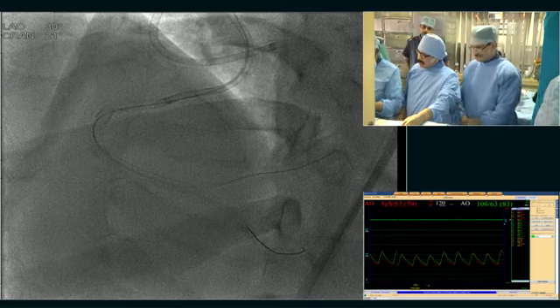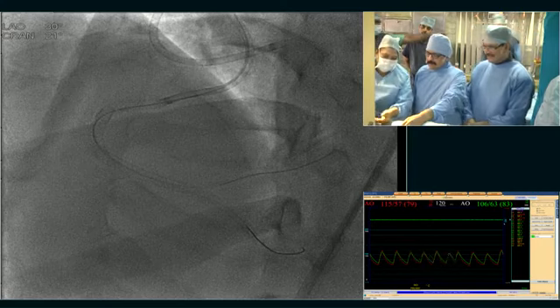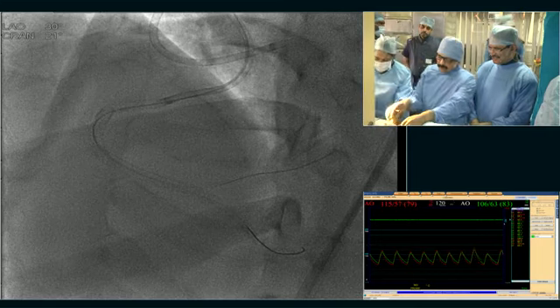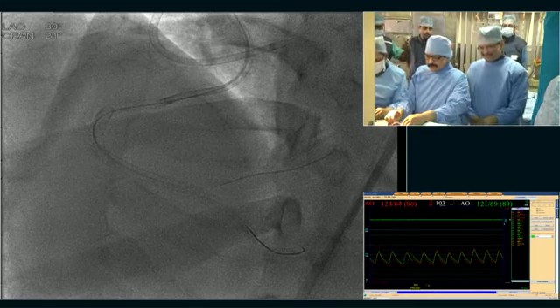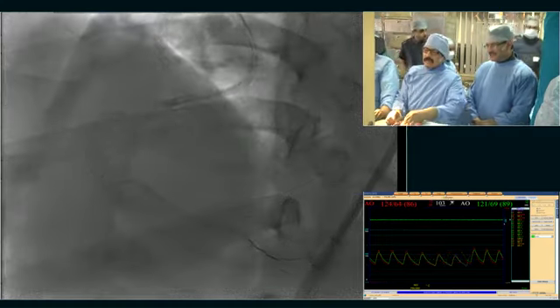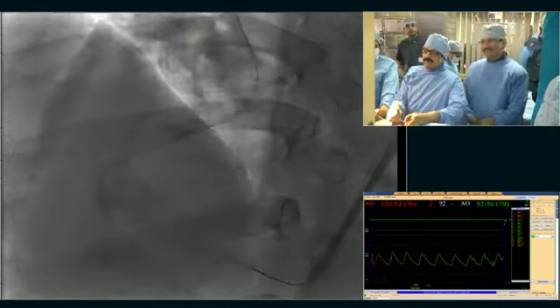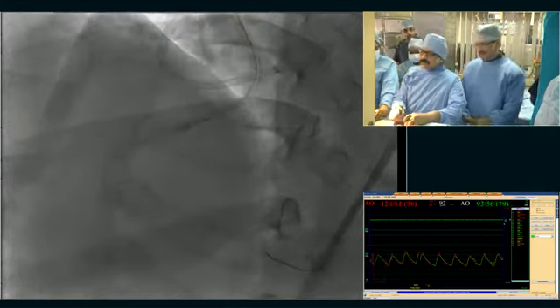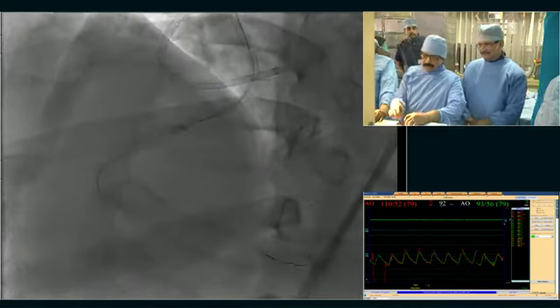So everybody is confident about the crossing of the balloon, 1.5. Tajuna? So far we are optimistic for this tough case. Hopefully, fine. For difficult lesions, tough lesions, Tajuna usually crosses this type of side branch ostium we have seen. So now we are confident.